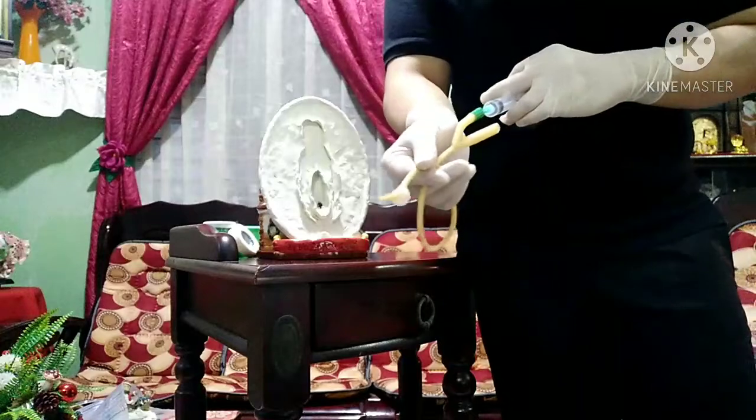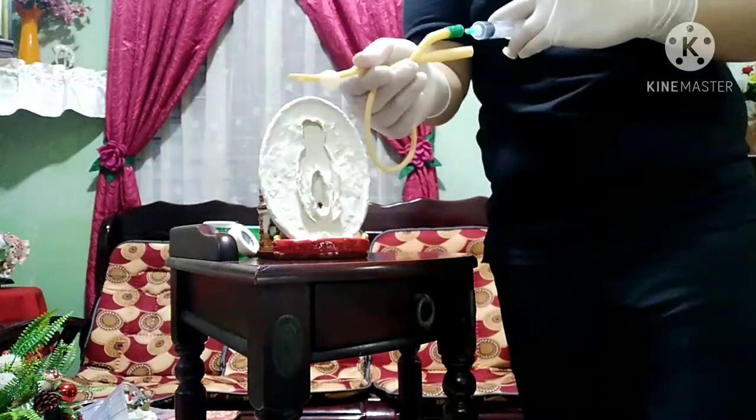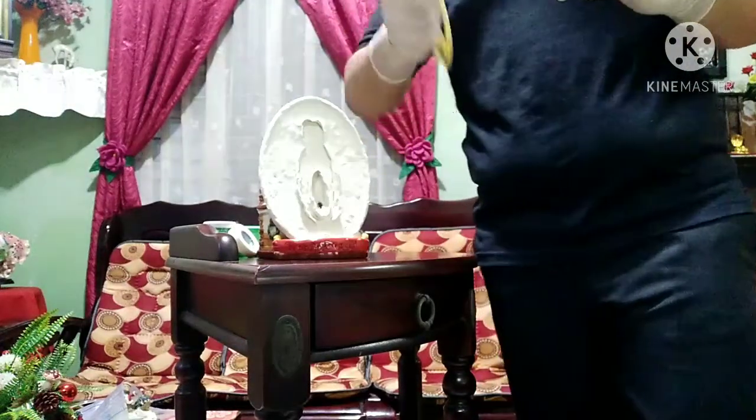As you can see, it inflated. And then we return it.